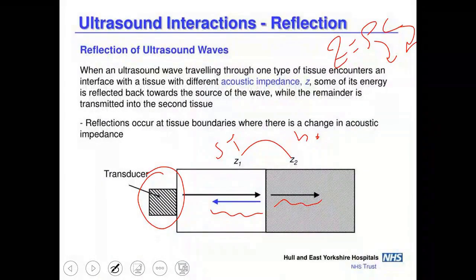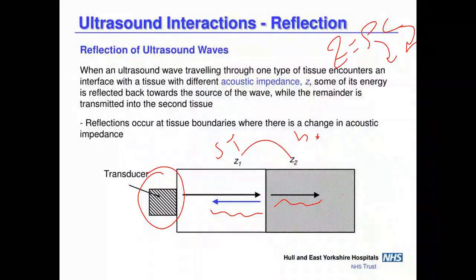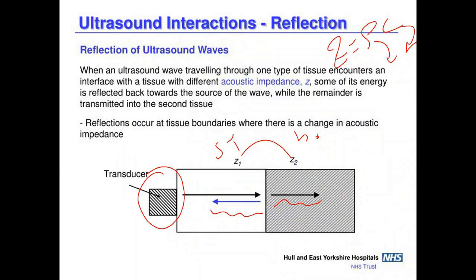The attenuating material or object can be stone or bone, or the low attenuating material in this case can cause the reflected signal to not experience significant attenuation, resulting in a hypersignal, which is called acoustic enhancement, as opposed to acoustic shadowing, as I will discuss regarding the ultrasound artifact. However, the topic of reflection depends on the difference in acoustic impedance between the two media.